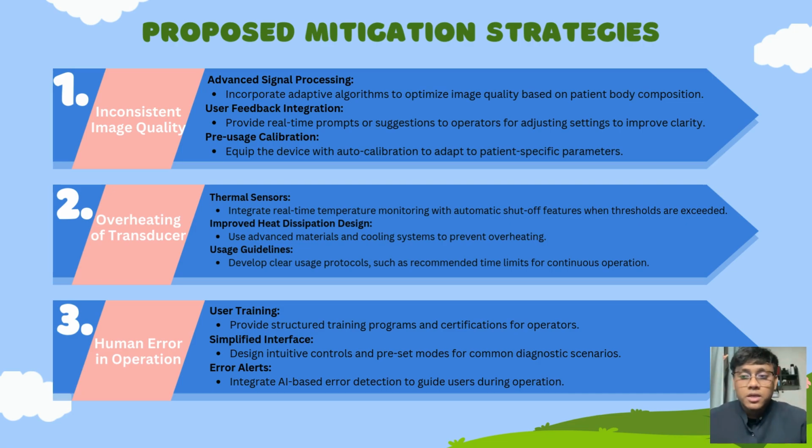First, we need user training. Provide structured training programs and certification for operators. Next, we have simplified interface. Design intuitive controls and preset modes for common diagnostic scenarios. For the last thing, error alerts. Integrate AI-based error detection to guide users during operation.